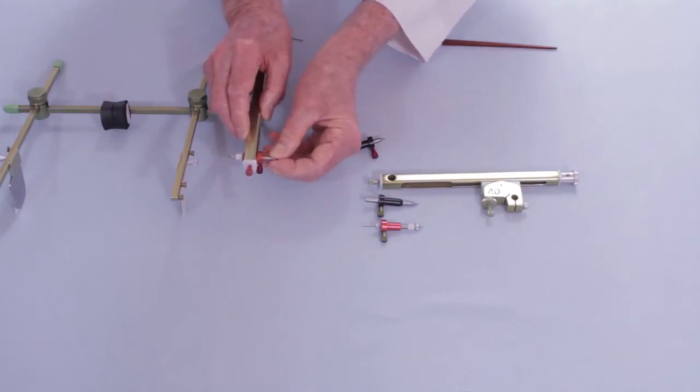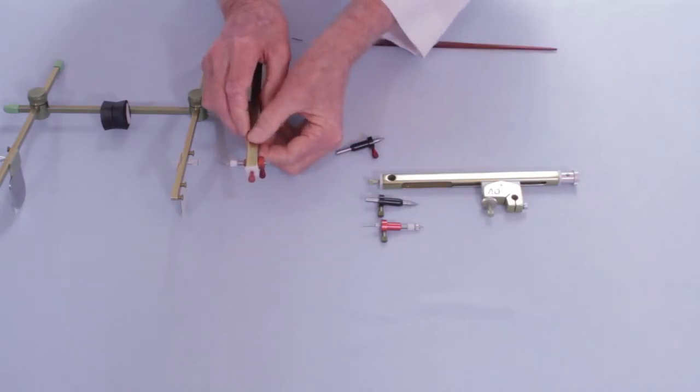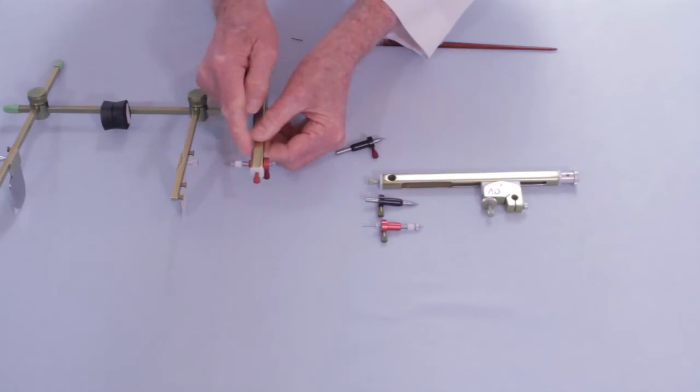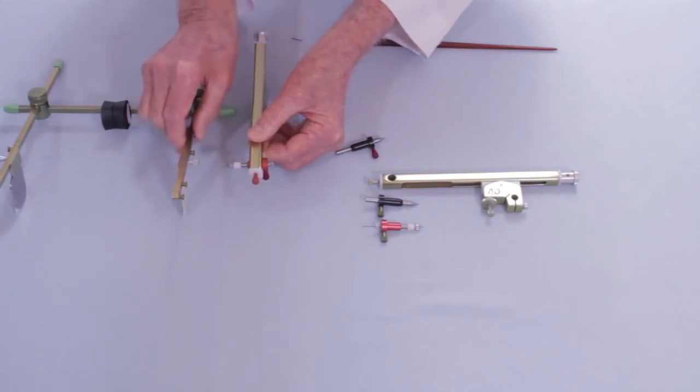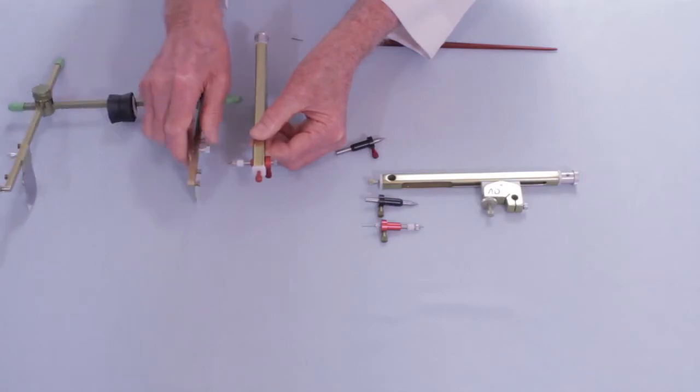The important thing is that when you release it, you don't release it like this because you may break the lead. When you release the spring tension, you let it go in slowly, touch the flag, and that's the reason that it's important. This distance now has been set so the writing pencil will work on the flag to record your movement patterns.